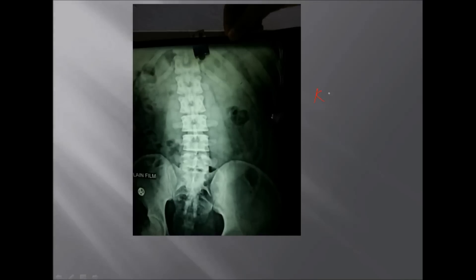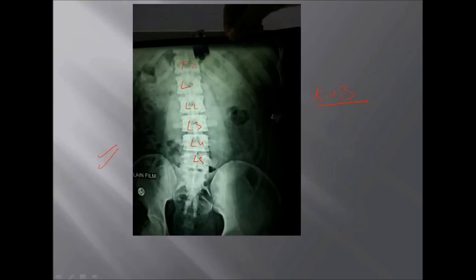This is a plain film of KUB. Just to give you a quick demonstration of how to view the associated anatomical regions: this is the lumbar vertebra, this is T12, then we count L1, L2, L3, L4, L5, then sacrum and coccyx. Here we have the psoas muscle lining, and here we have the ascending colon where we can see luminal gas. Here we can see the kidney region.